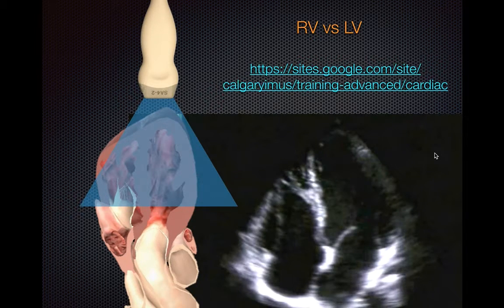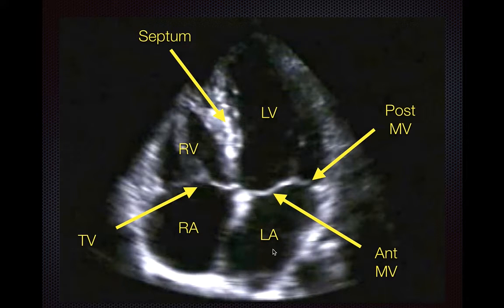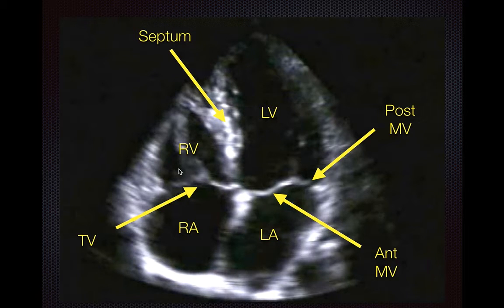In terms of the structures you're looking at: you have your left ventricle, the posterior mitral valve, the anterior mitral valve, left atrium, right atrium, tricuspid valve, and the septum in the middle with the right ventricle on the other side.